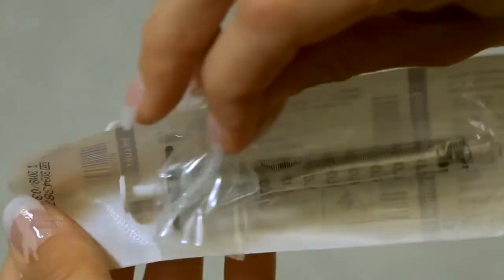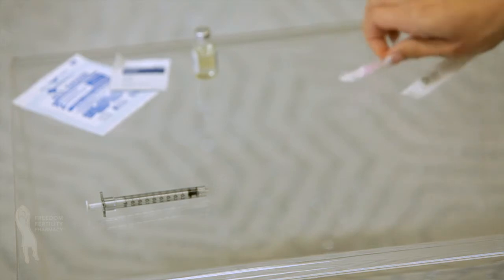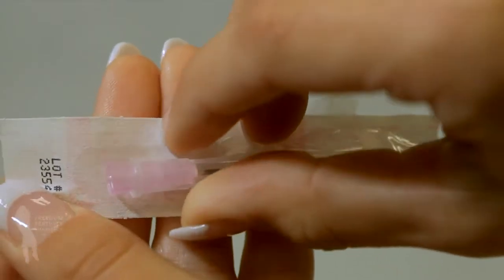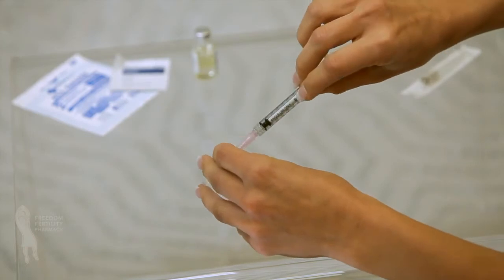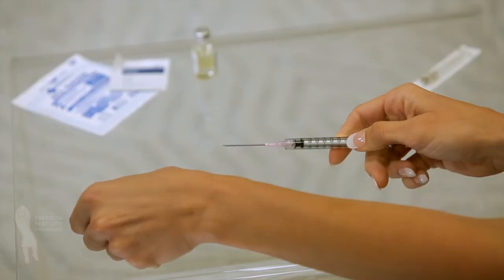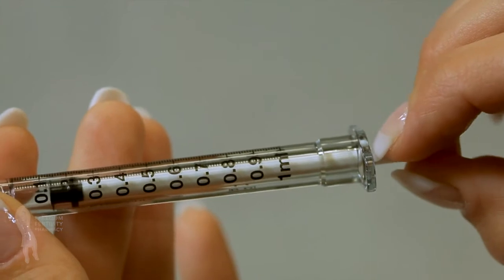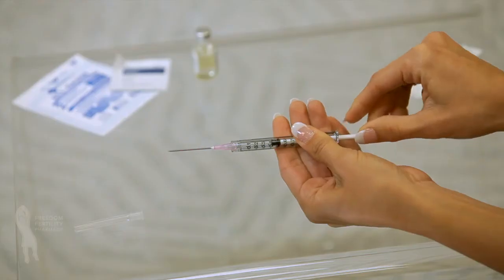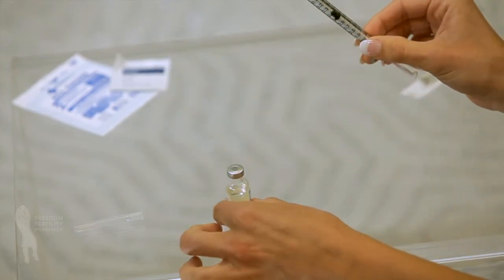Remove the wrapping from the syringe and drawing needle. Twist the needle onto the syringe. Carefully pull or twist off the protective needle cap. Draw air into the syringe by pulling back the plunger to the milliliter or cc marking that you have been instructed to take. Place the vial of Delestrogen or estradiol valerate on a hard, flat surface.